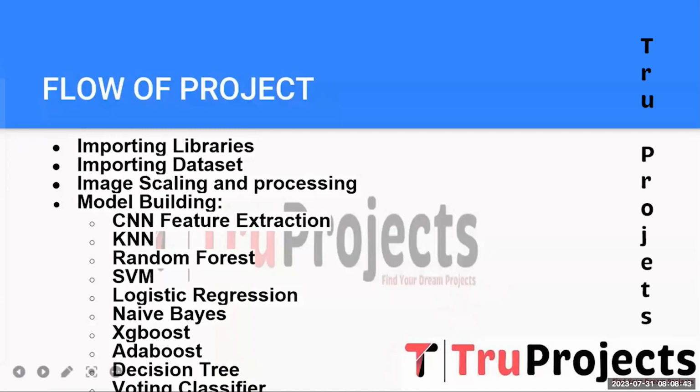And the next one is AdaBoost. It stands for Adaptive Boosting, and is another ensemble learning method that focuses on misclassified instances during the training process. It assigns a higher weight to the misclassified samples, allowing the subsequent weak learners to focus on previously challenging cases.